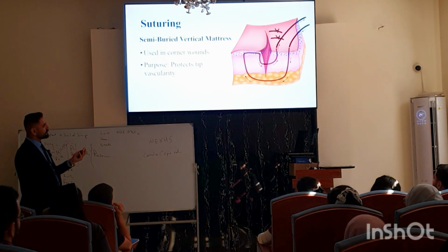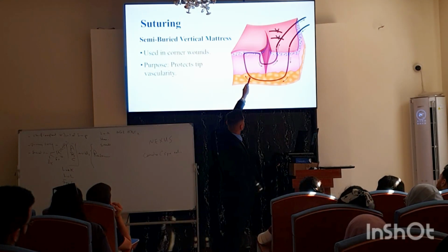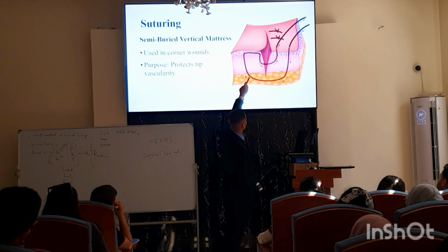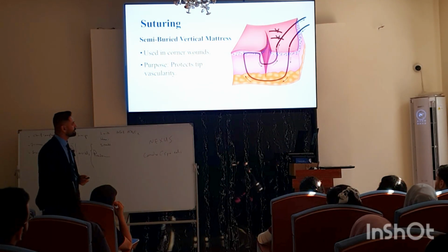It's very useful in avoiding disruption of the vascularity in this area. So these are the vessels in the dermis. So our suture should interrupt them less than when we take it through the skin and go back in again. So this is the idea behind it.